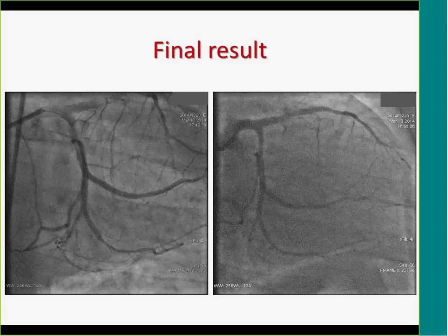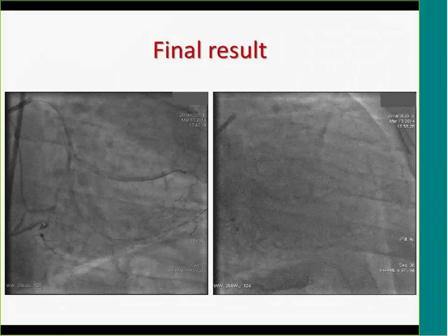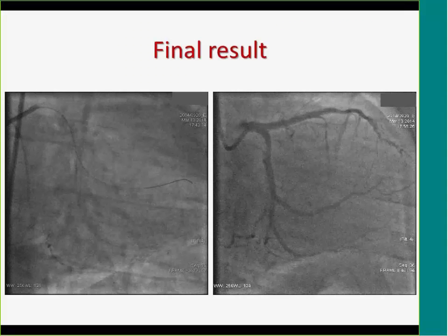So for better revascularization, finally we did the LAD as well.